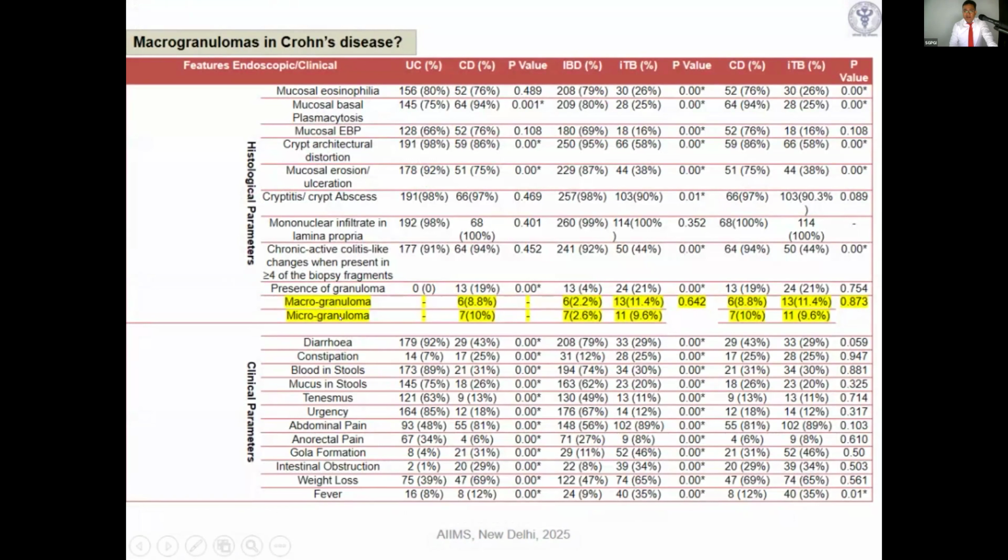But please remember, in Crohn's disease also, this is the Crohn's and this is tuberculosis, we can see macrogranulomas in few cases. So there will be some scenarios when the patient is phenotypically Crohn's, but you can see large granulomas. But in practice, in most cases, in 90 to 95% of cases, if you see large granulomas, the first possibility you have to suggest is favoring tuberculosis.